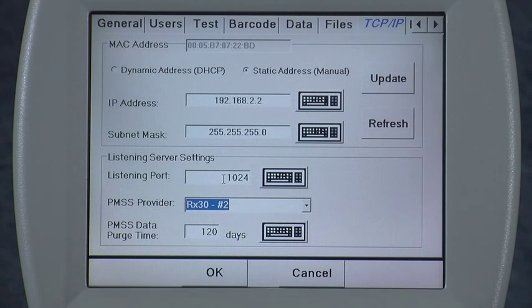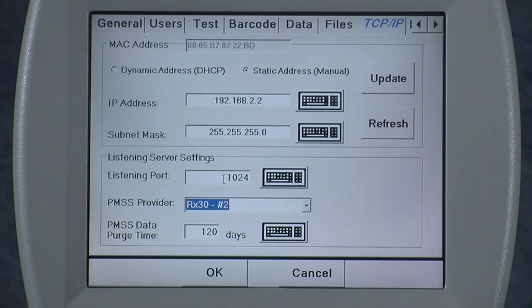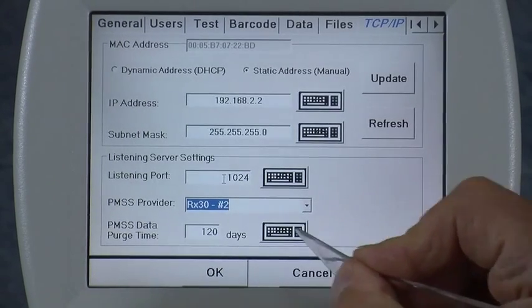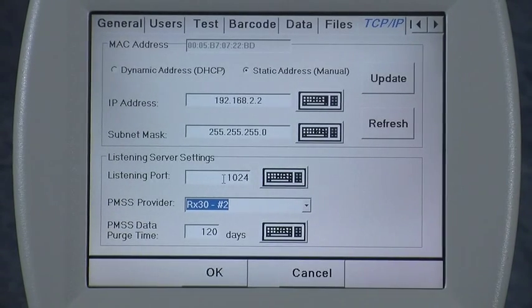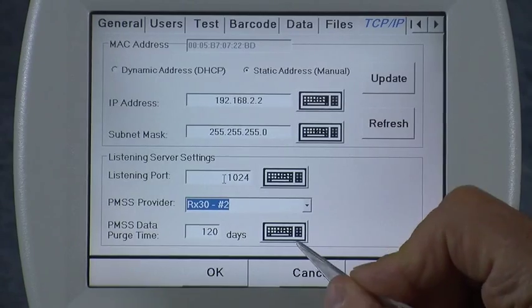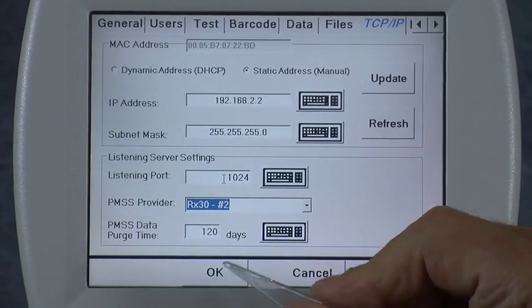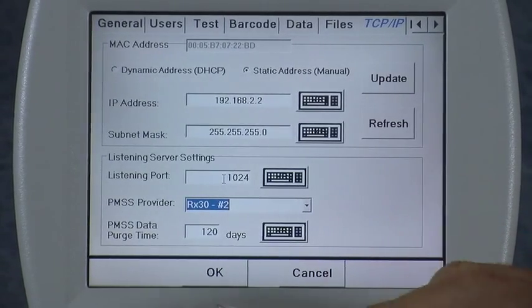For example, if you do a partial fill today for Mrs. Jones and want to come back in four months and scan that same prescription label, you want to make sure this is set for at least four months for the icon to recognize it. 120 days is the default and works for most people.